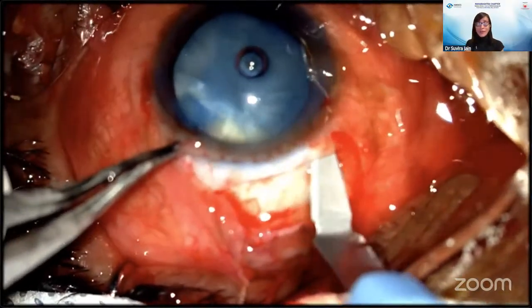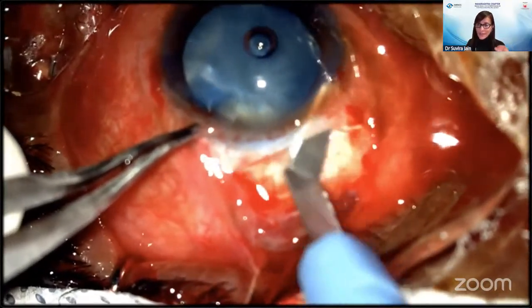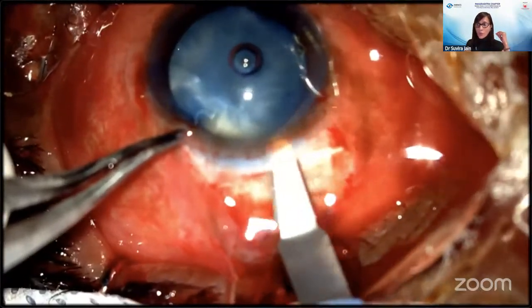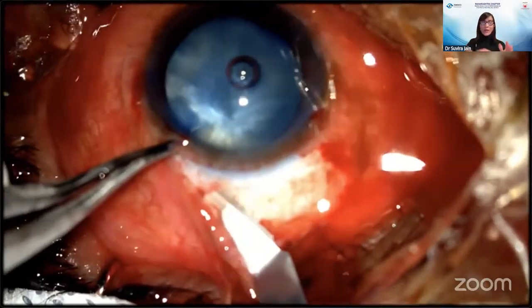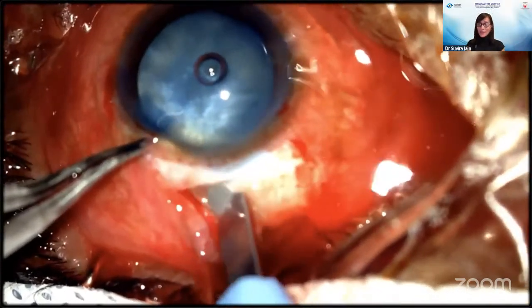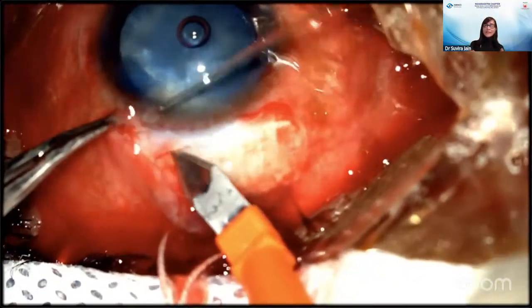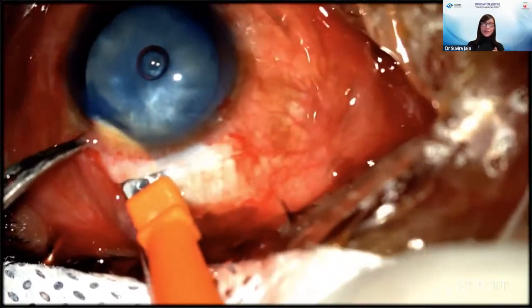Based on this webinar and any other surgeries that surgeons have done in the past, it's worth defining for yourself what is going to be your technique of choice, because when disaster strikes, we've got to act fast. We've got to know how we want to complete the incision because we want a self-sealing tunnel at the end of the surgery. For me, I was very happy to make it almost at a completely different plane. Then I went ahead and enlarged the tunnel.